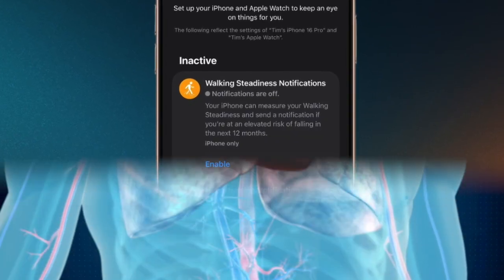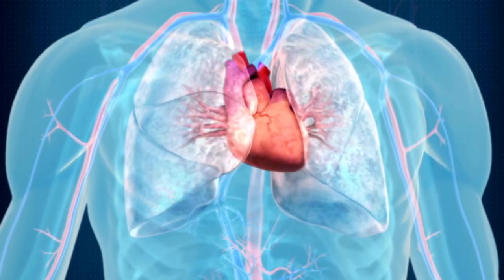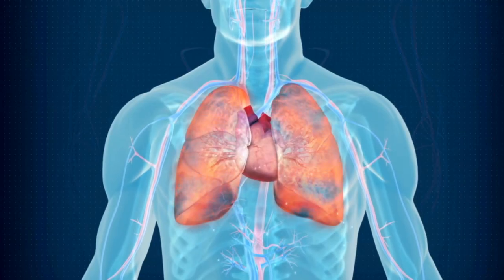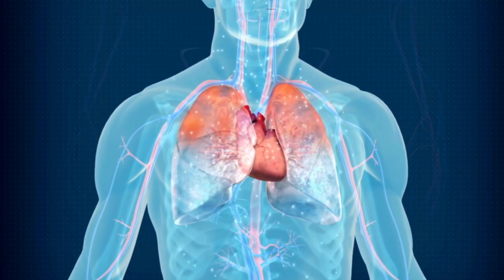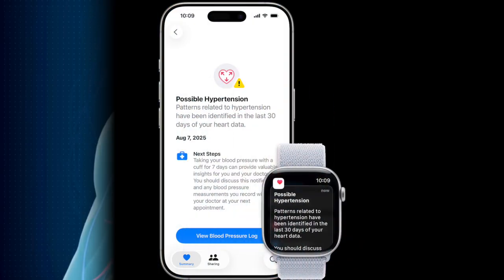The activation process includes reading medical disclaimers and acknowledging the feature's limitations. Apple Watch hypertension monitoring is intended to supplement, but not replace, regular medical monitoring — so make sure to keep this important point in mind.